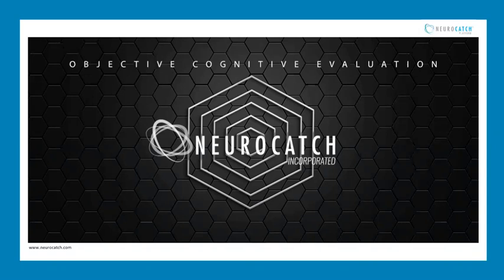Congratulations, if you're watching this module, you have gotten through Module 1, Brain Basics, and we're moving on to Module 2, which is really to focus on the specific results of neurocatch and train you to be able to understand the waveforms. And today's module is about the same length as Module 1. I'm just going to do a quick review of Module 1 just to refresh you, and then we'll dive into Module 2. So in Module 1, we did the basic brain components that contribute to neurocatch.